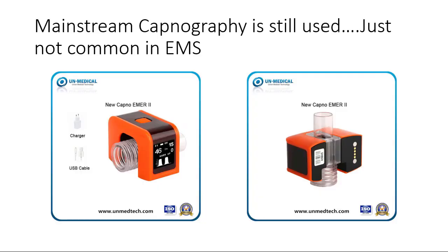These are still in use though. This is one that's on sale right now. I can't tell you how often it's used in other countries, and I can't tell you how often this method of quick checks is actually used in the United States anymore, but it is used in other places. You see a little waveform on the side, but I don't know how you would document this. There's no capnograph to print off. It's just a little quick waveform on the side there.